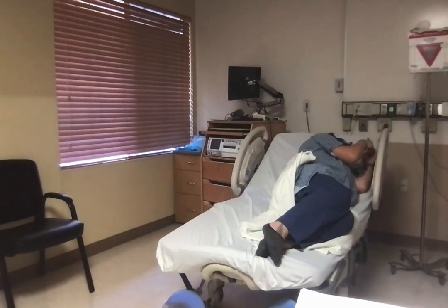15 minutes go by, and recurrent variable decels have resumed. The nurse re-enters the room to continue patient care. Upon re-entering the room, the nurse performs hand hygiene.